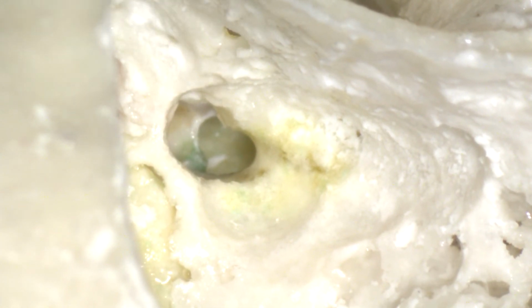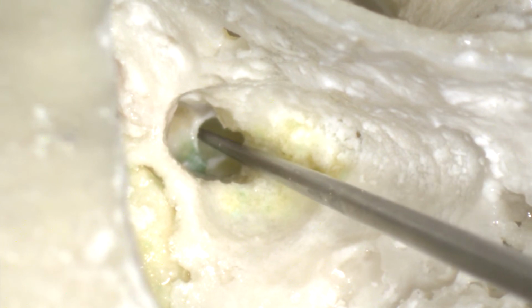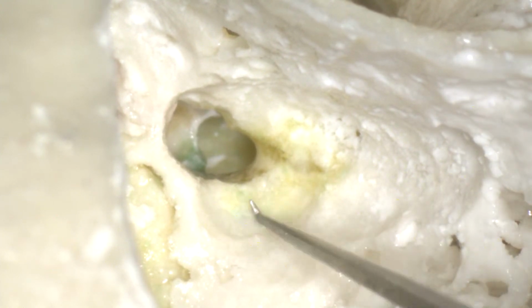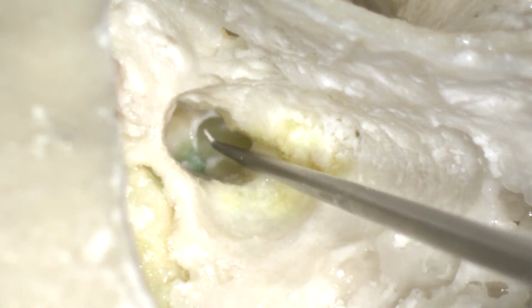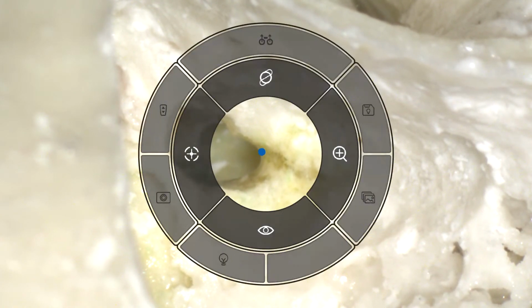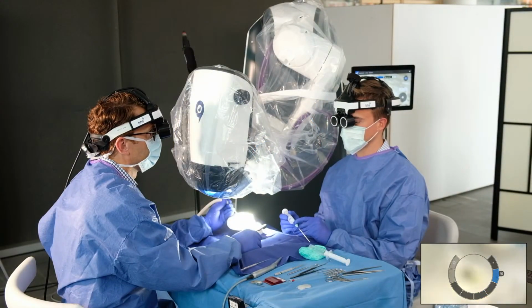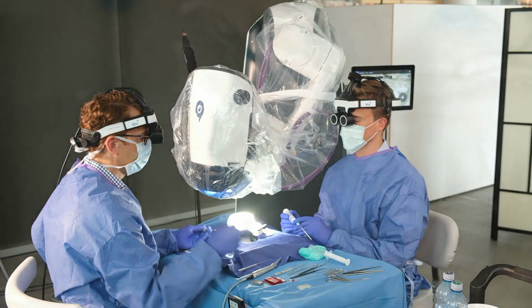I can show you with the needle, and you see that I still can sit in a very optimal position, and here you have now the round window, and here the chorda and facial nerve angle, and so it's easy to visualize this region of interest in my surgical field. And to get a better overview on the surgical field, I can defocus a little bit, and this is very easy as well. So now I have the perfect view here on the window.